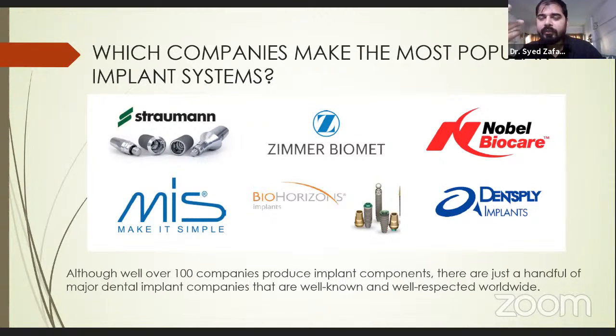I usually use this kind of implant when the patient is paying 4 times as compared to the normal implant I use in my practice, because this implant is very expensive. But this implant is internationally recommended. Even if you are placing it in any country, and your patient goes to any country like America, he can find this part anywhere in the world. Especially Straumann, Nobel Biocare and Biohorizons. They can find their parts anywhere on earth.